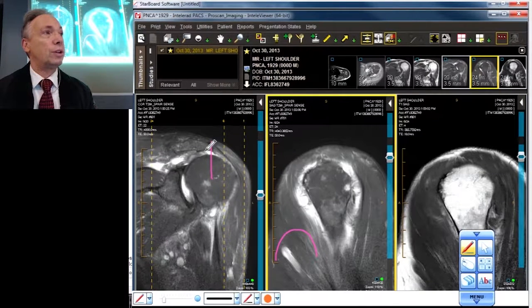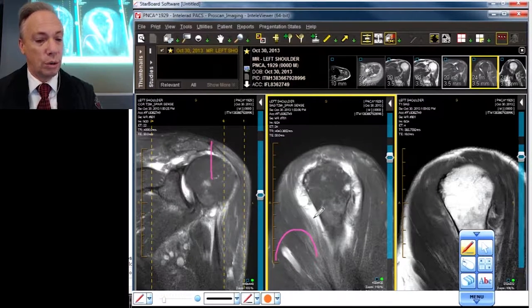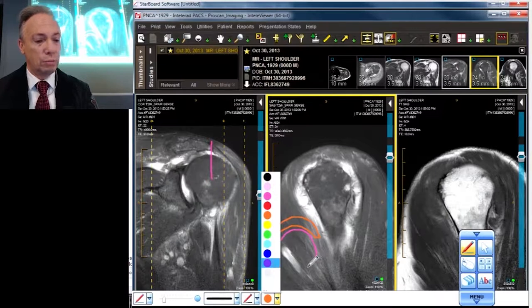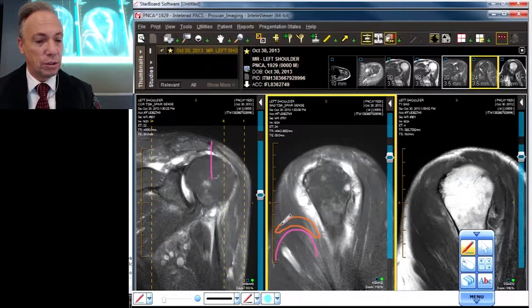The reason you don't see any muscular tissue here is because the cuff is ruptured — so don't be worried that you don't see it coronally. But in a normal shoulder you'll see some muscular tissue, which I'll make orange, and within that muscular tissue — which will include several different muscles, the supraspinatus and infraspinatus — you're going to see some individual tendon subunits.